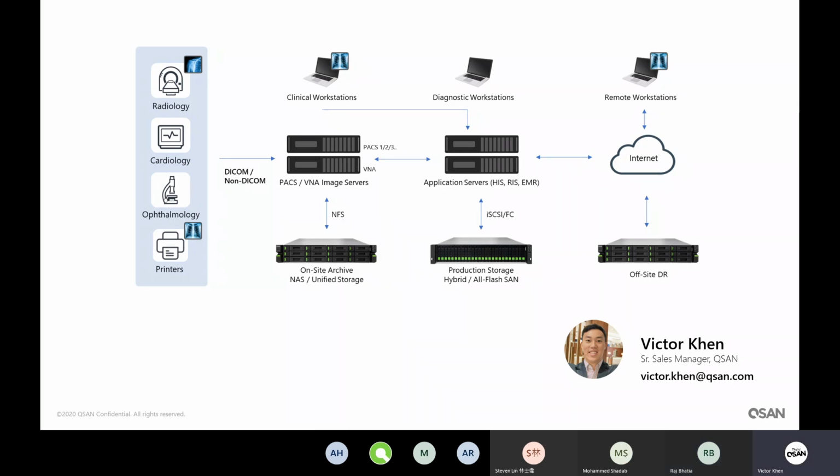If they would like to use different platforms like SANs and NASes together in the same system, we would need third-party backup software installed on the server side. But usually, in our case, the customer would choose one storage, like a SAN or NAS, installed on the main side, and similar storage on the off side. So if it is a SAN on the backup, they would use a SAN as well with the default replication services.